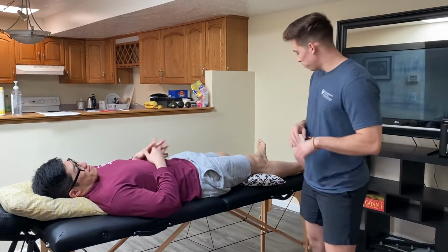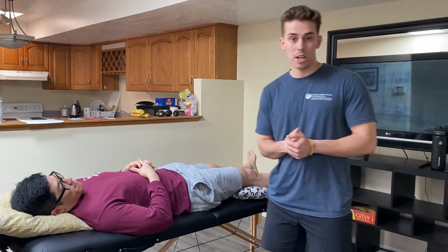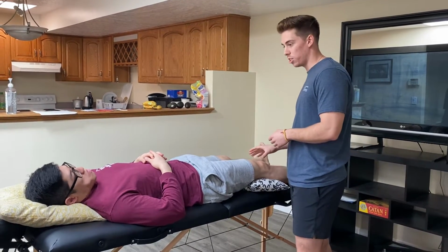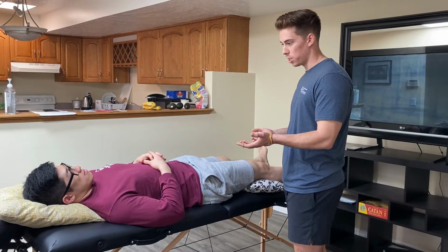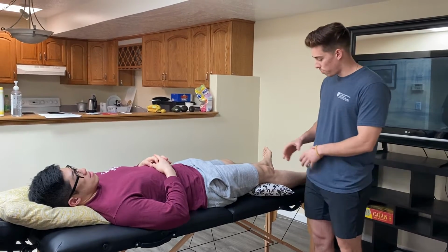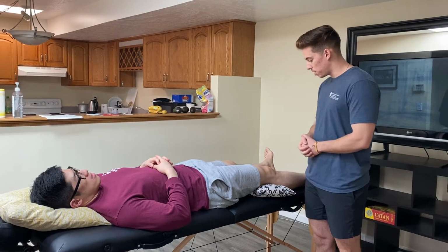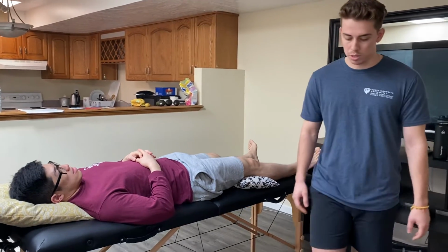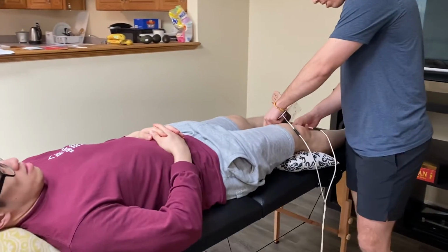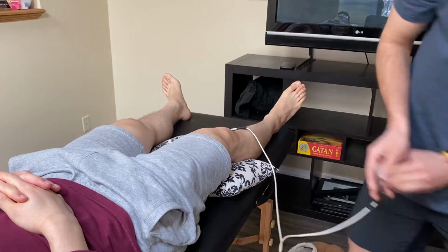Okay, good. So, a couple things we want to do before we actually start him on the TENS. First is see if he has any of those contraindications. Do you have any history of blood clots or hemorrhaging around your knee? No. Do you have a pacemaker? No. Okay. Just things like that we want to double check. We also want to check to see how his skin is looking. Like we said before, we don't want any damaged skin. Right now his skin looks fine, so we're safe to go ahead with the treatment. So what I'm going to do next is place these around his knee here, just like this.